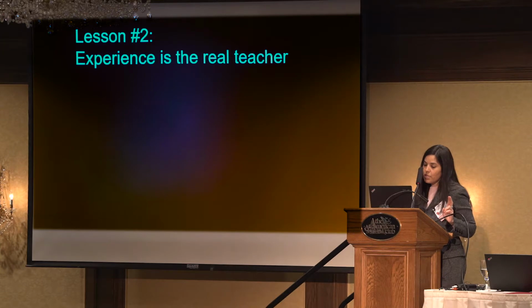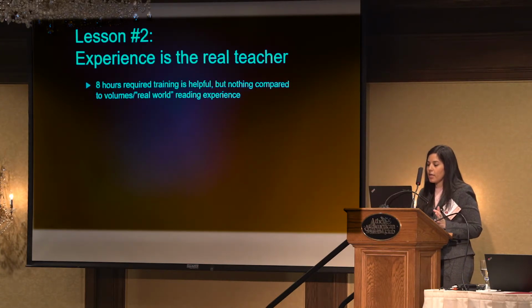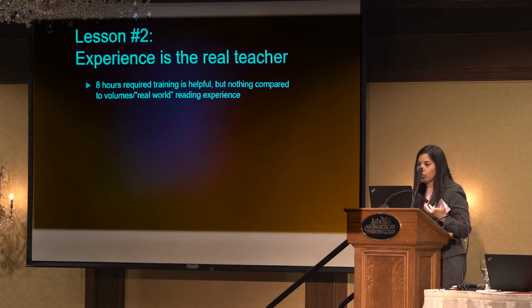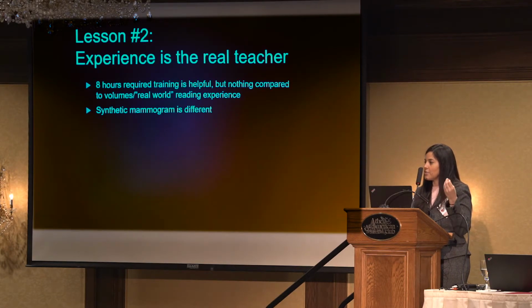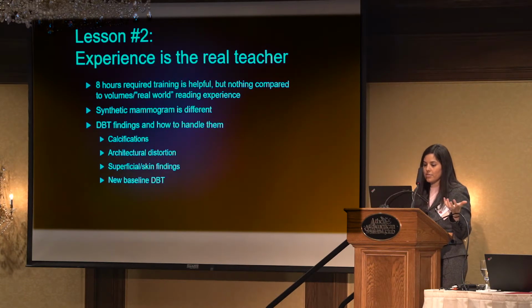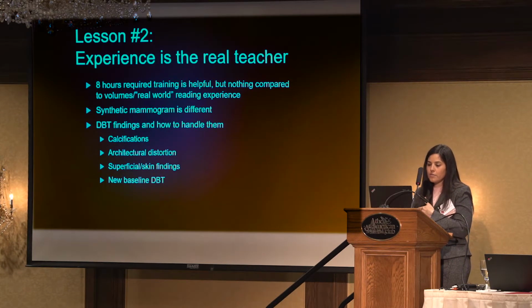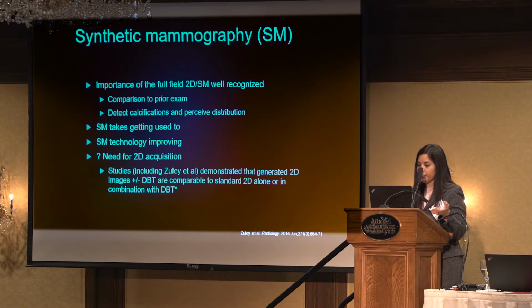Lesson number 2, really experience is the real teacher. Those 8 hours of required training are nice, they're helpful, but your first tomosynthesis exam, you need that real world, real reading experience. Adjusting your eye to that synthetic mammogram takes time. It's not the same as a 2D mammogram. And then there are a host of DBT findings that are a little bit different than on 2D mammograms, and figuring out how best to handle them can be a challenge.